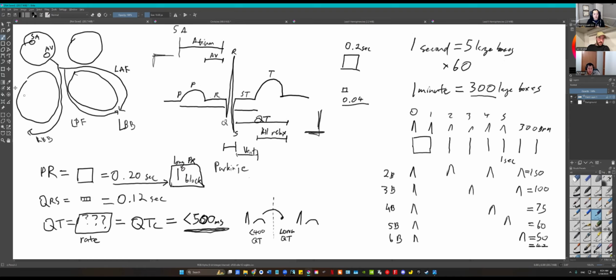If you can use this image, if you can draw the anatomic heart, get to SA, AV, and then these bundle branches, you can trace yourself this QRS tracing. And then from here, like the PR, the QRS, the QT, if you can just remember that the back half from the QRS to the end of the T wave is the ventricle contraction and relaxation, you can figure out a lot of physiology.